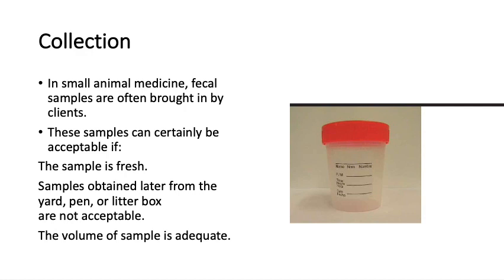The volume of sample should be adequate. A minimum of 10 grams of fresh feces should be collected. In large animal medicine, fecal samples are collected directly from an animal's rectum if possible.